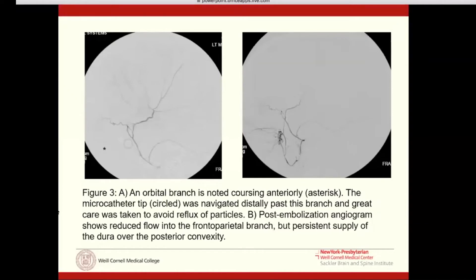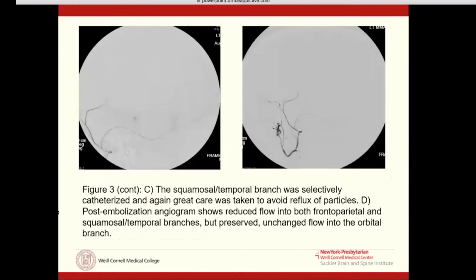Here you see on the left a prominent ophthalmic artery collateral. Some people have ophthalmic arteries that feed their eyes; some people have the MMA with an ophthalmic collateral that feeds their eyes; some people have both. It's very important to be aware of these collaterals when doing an embolization. When you see that, you can go into each branch selectively. On the left is what it looks like after embolizing the frontal branch, then we pull our catheter back, go into the temporal branch, and on the right you see what both branches look like after embolization with preservation of the ophthalmic artery.